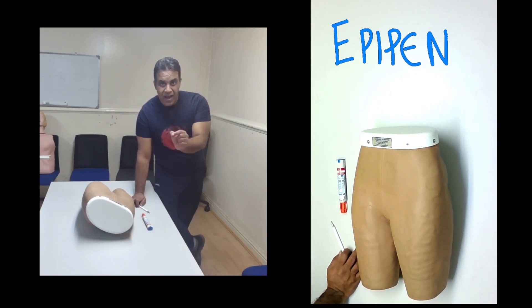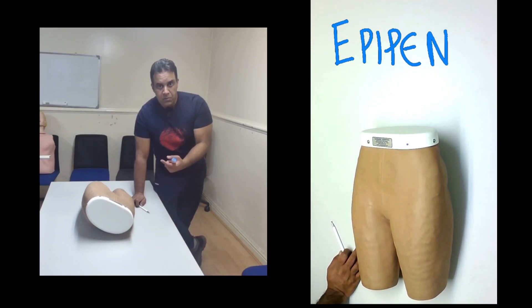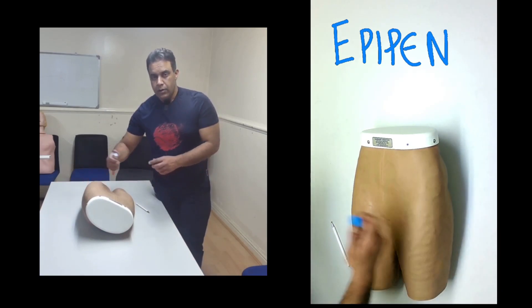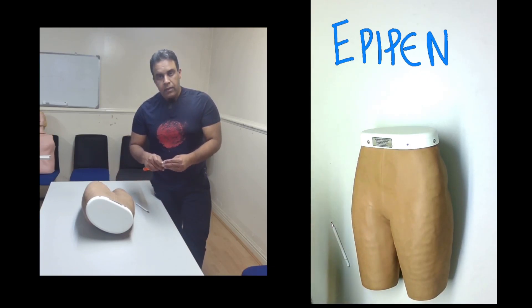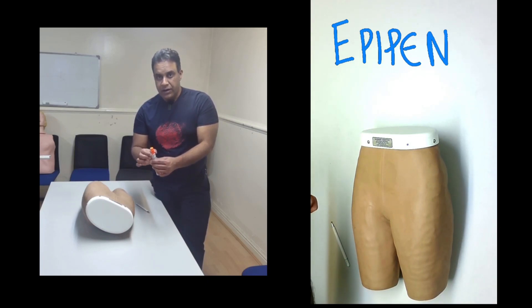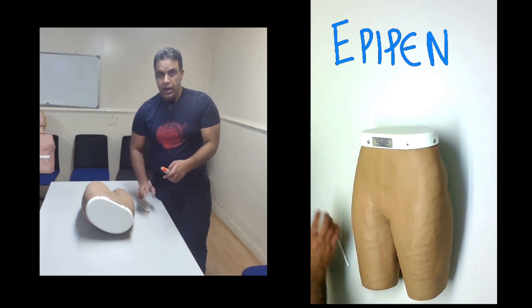Ideally, the patient should have two EpiPens. They should wait a maximum of five minutes; if they do not feel any benefit, give one more dose. In the meantime, hopefully the ambulance will arrive. After you have injected, you can see this orange part has come out — it is the safeguard for the needle. You will not see the needle at any point.